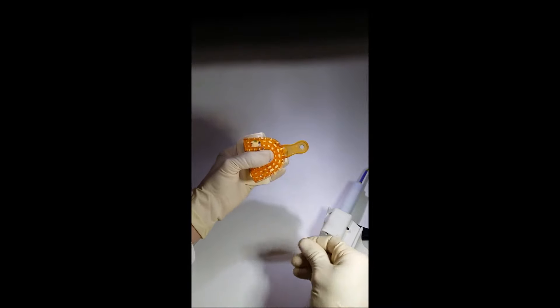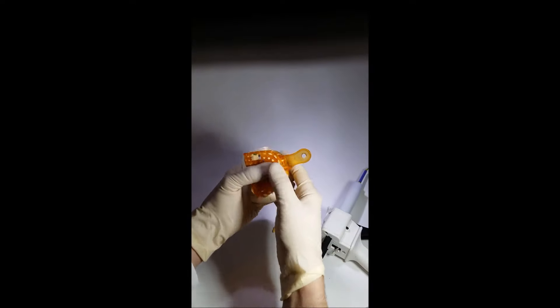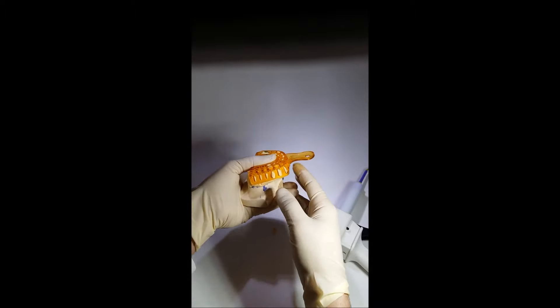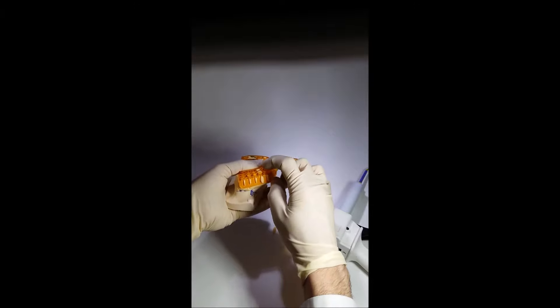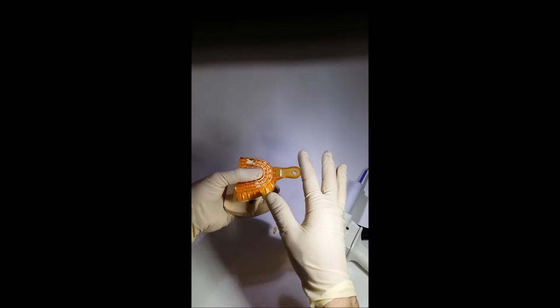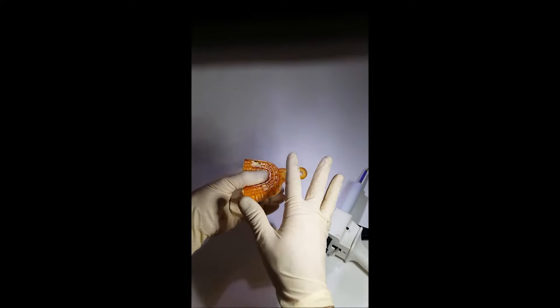Try to hold the tray still. It may be difficult with plastic trays, so it is better to use reinforced trays — thick-walled and non-elastic. It is better to use plastic trays for the open tray impression technique because this tray may be easily perforated. Metal impression trays are better for the closed tray impression technique.